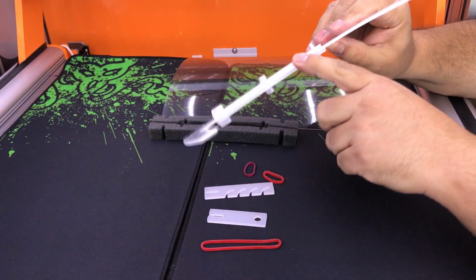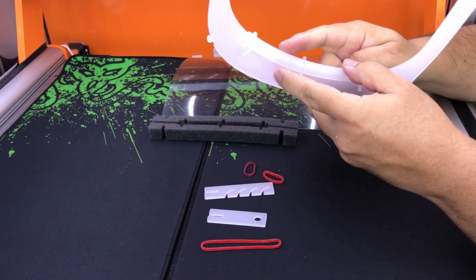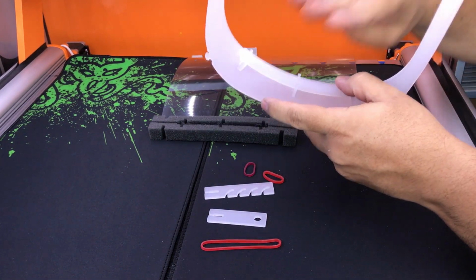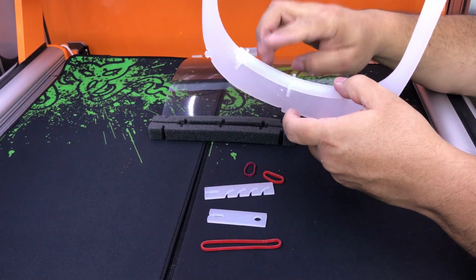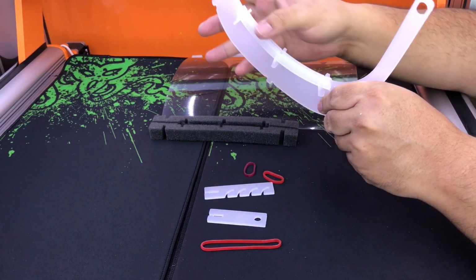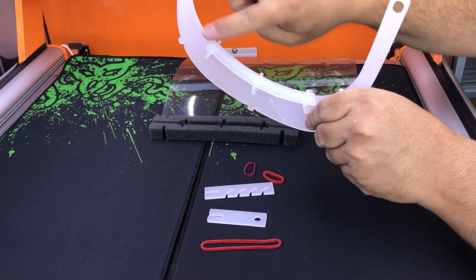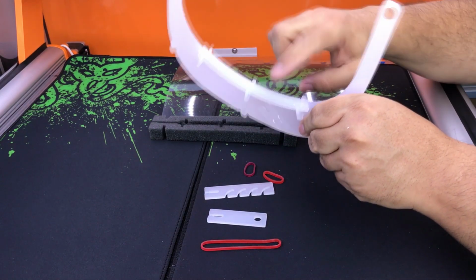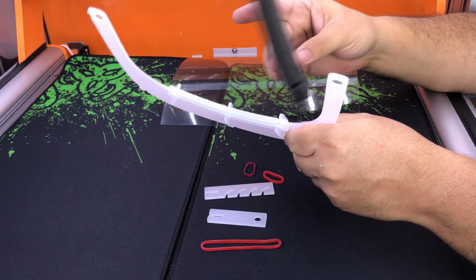These parts are designed to make this part thicker. So when you put the mask on your forehead, these have more surface to stand. That's the only reason for this part. If you design only this line, this will hurt your forehead, no matter if you put this.